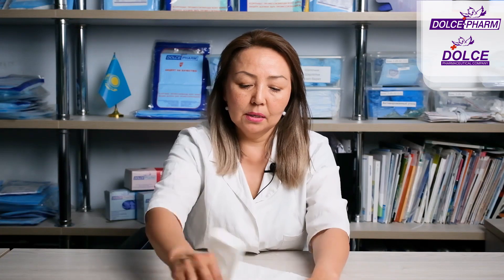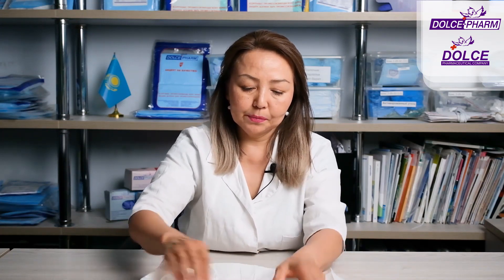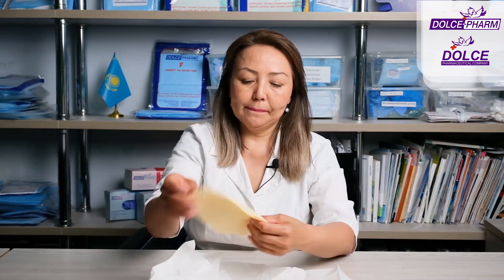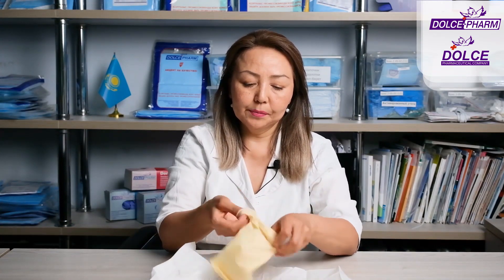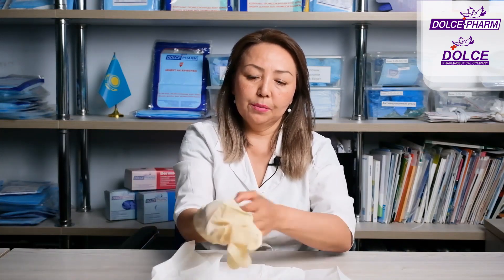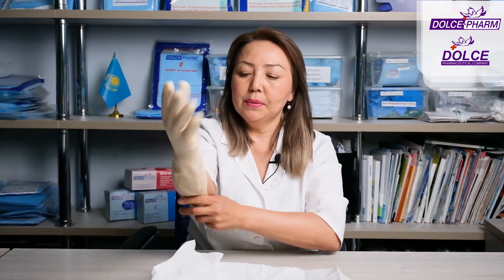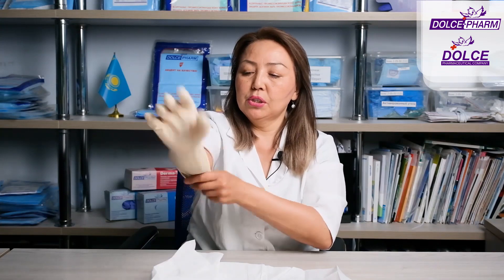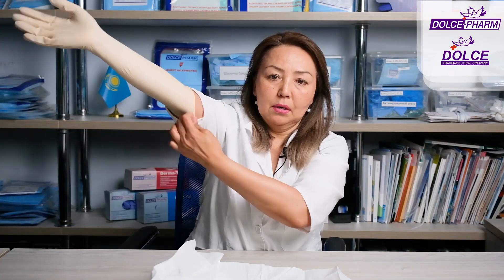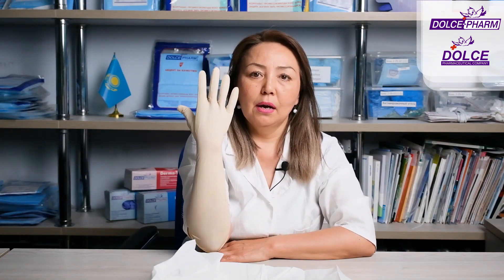Let's open the gloves and see what they look like. Gynecological gloves — they're long. These are the longest surgical gloves. Examination gloves start from 24 centimeters, and surgical gloves start from 30 centimeters. As you can see: long cuff, latex, smooth, non-powdered, sterile gloves.